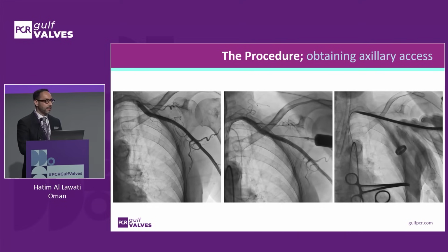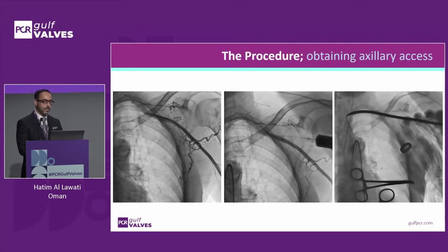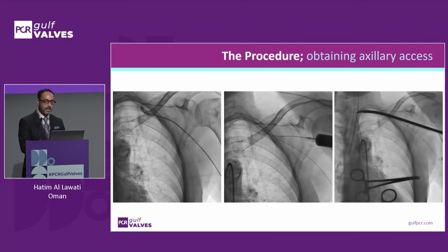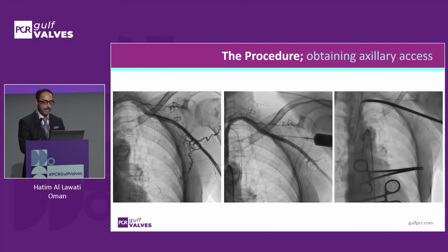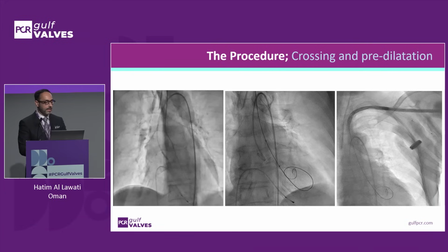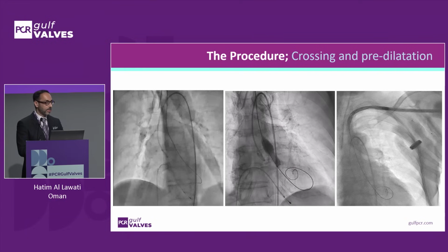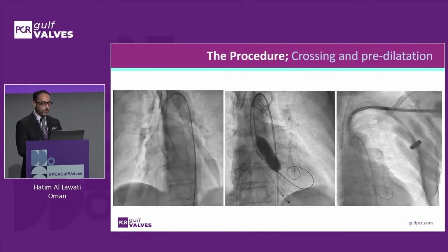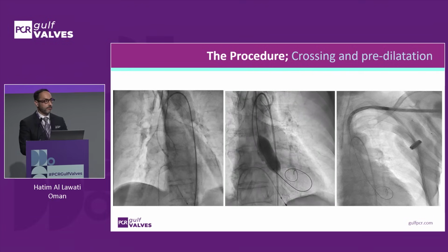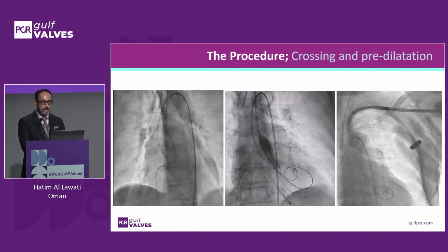The dilator had some difficulty making that 90-degree angle into the aortic arch, and after a little bit of push and pull with the wire, it eventually made the curve into the ascending aorta and dilated the tract. After inserting a 14 French sheath, the aortic valve was crossed in the standard fashion. The valve was pre-dilated with an 18 millimeter ZMED balloon, and the 14 French sheath was exchanged out for the FlexNav system.